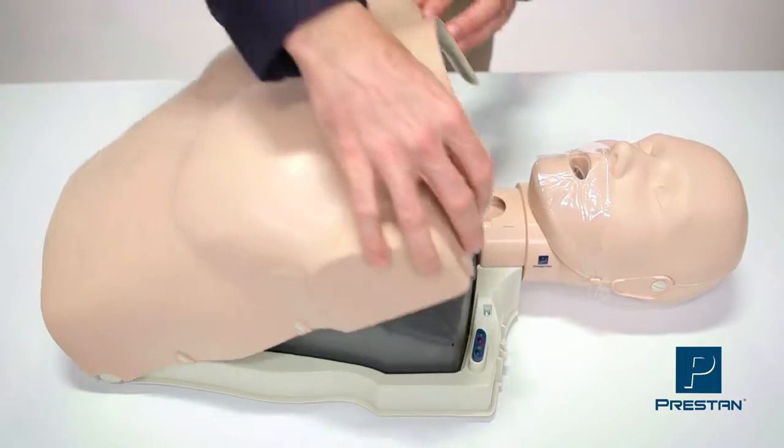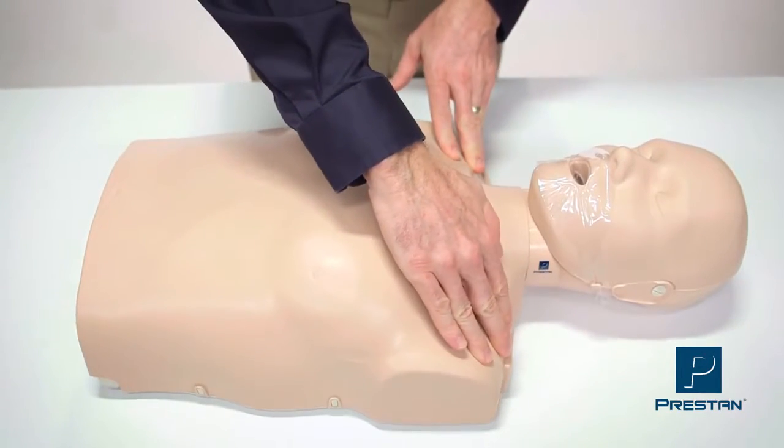The small hole in the neck allows air to escape for deflation. Close the torso and snap shut the tabs. You are ready to train.